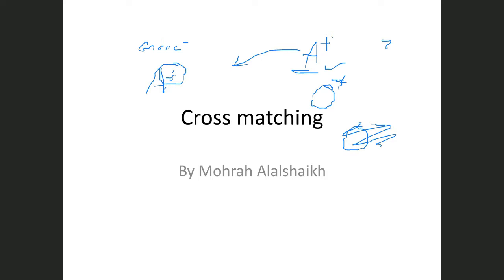So compatible does not mean identical type, but it is compatible, so we don't expect a hemolytic transfusion reaction as a result of the transfusion. So the first choice is A positive, and the second choice is O positive also, but at the same time, as you said, it has to lack the small c antigen.